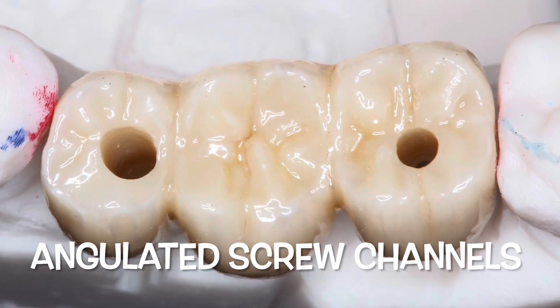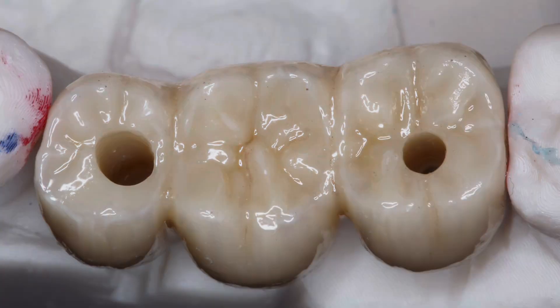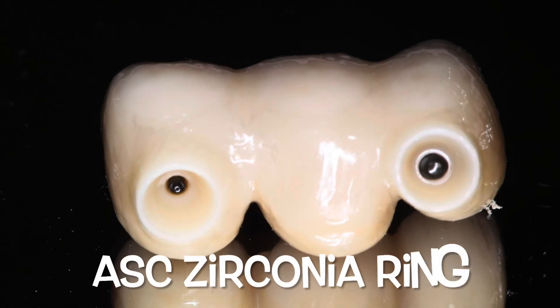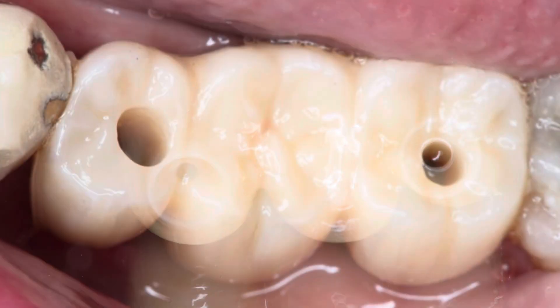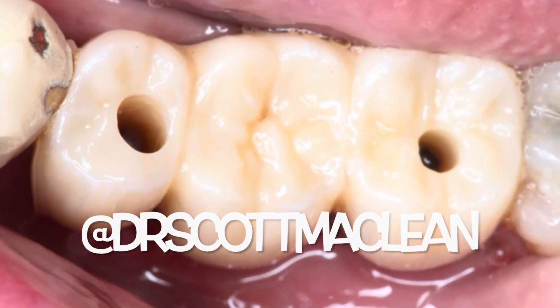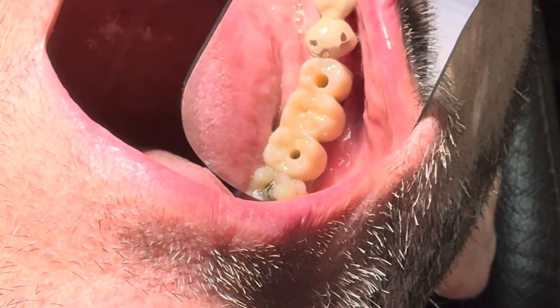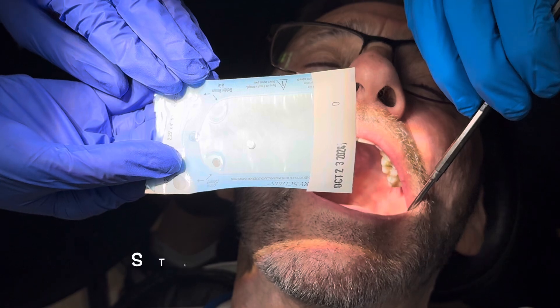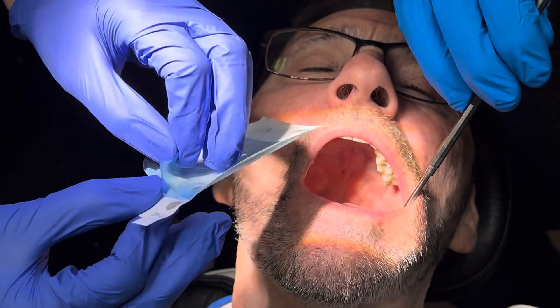The angulated screw channels are amazing for a three-unit bridge. The system also has a zirconia ring, which means there's no tie base — no small cemented piece. The bridge sits right on the multi-unit, so you don't have another stackable part to the system, which can sometimes be very thin and show through the tissues.